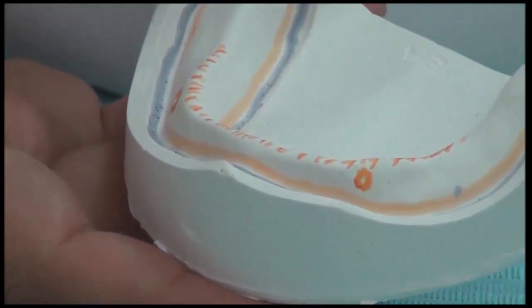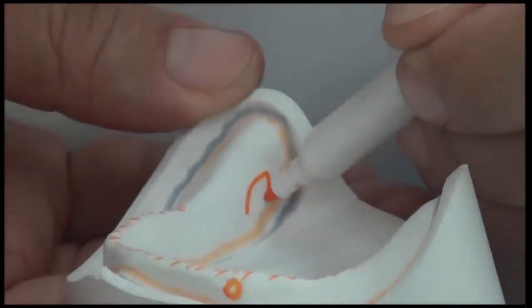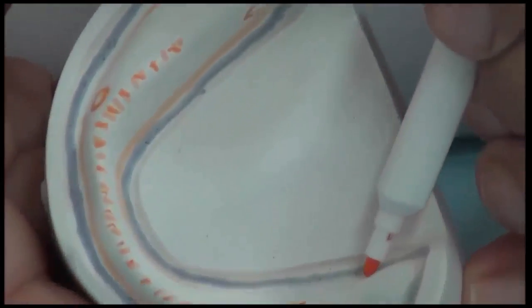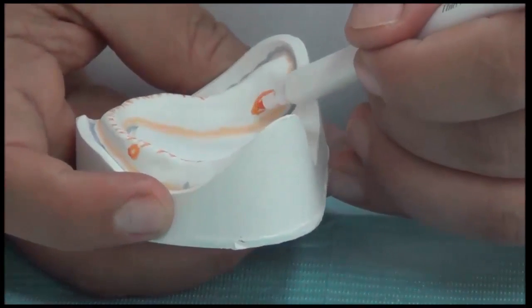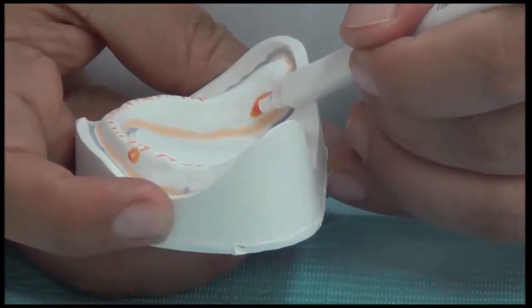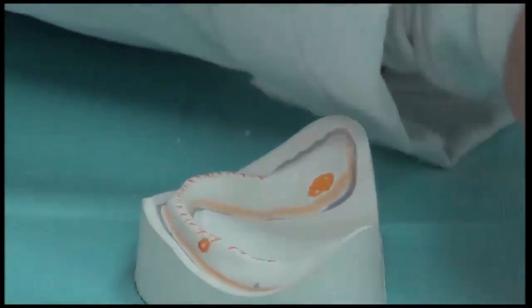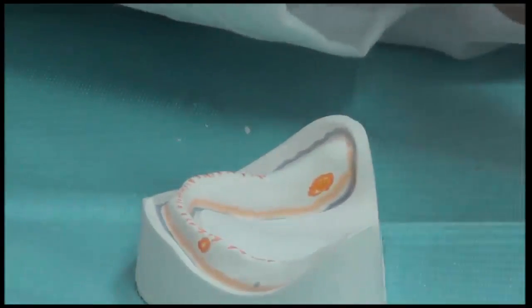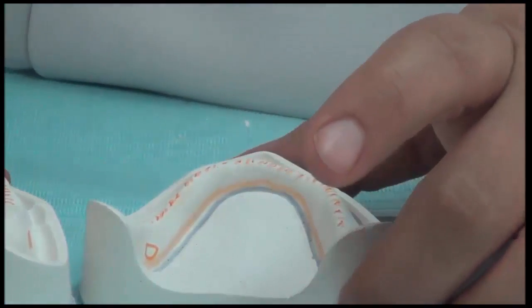In many cases, the places where we usually face undercuts are around the lingual pouch, from the linguodistal area. Sometimes we have undercuts. If we have the issue of undercuts and bulbous exostosis before this undercut, it will be covered by thin mucosa and we should relieve them. So these are the areas of relief and support in the upper and the lower.